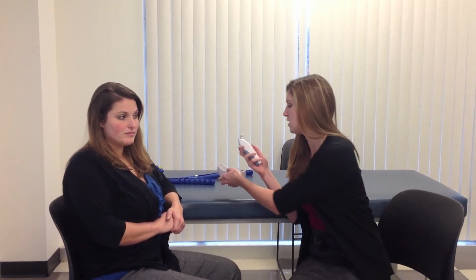So today I'll be taking Katie's temperature with an ear thermometer. If it's a child, you're going to want them on your lap. With a person, you just have them sit. I'm going to place the thermometer in your ear, and I'm going to hold the button for 1 second. Her body temperature is within normal range, 98.1.